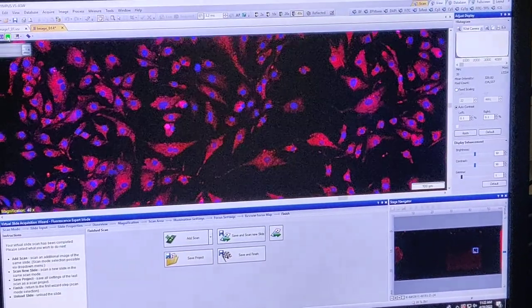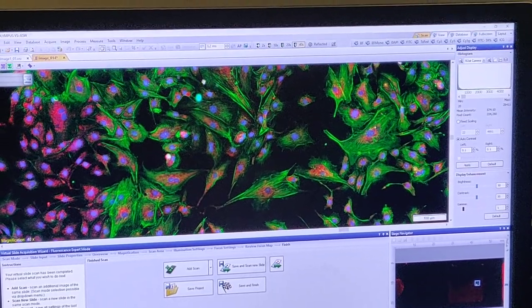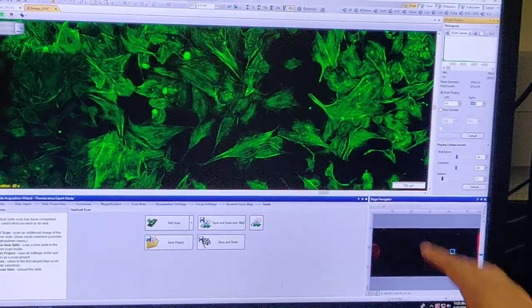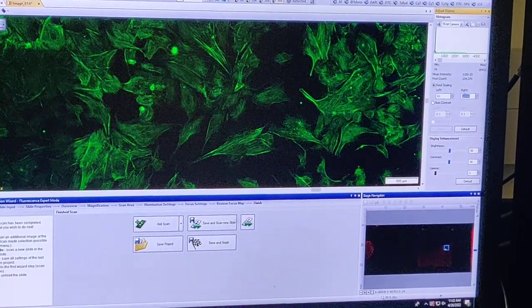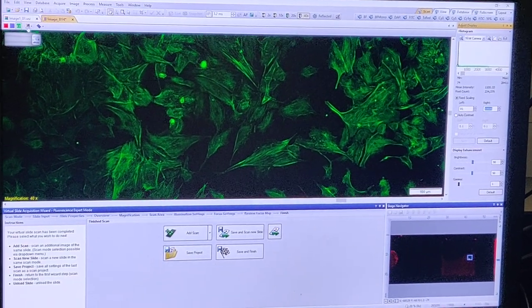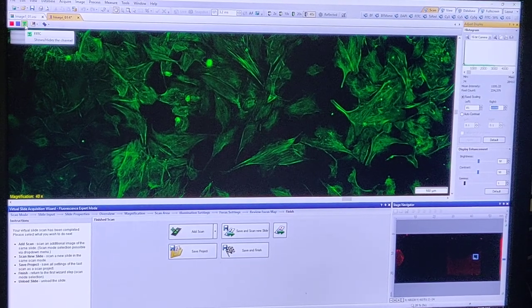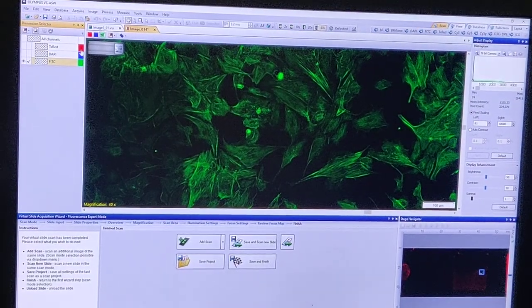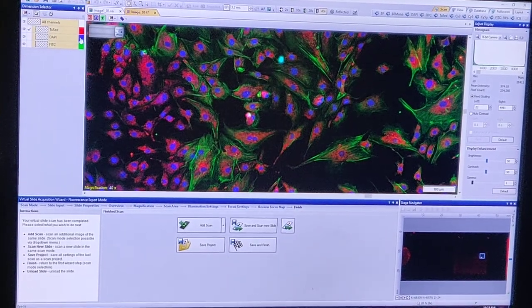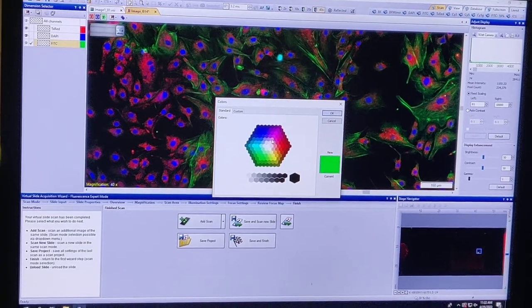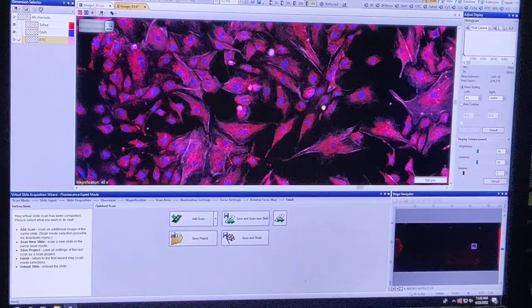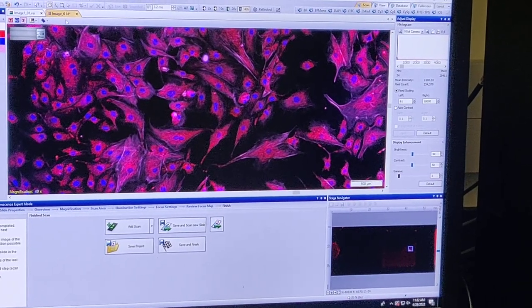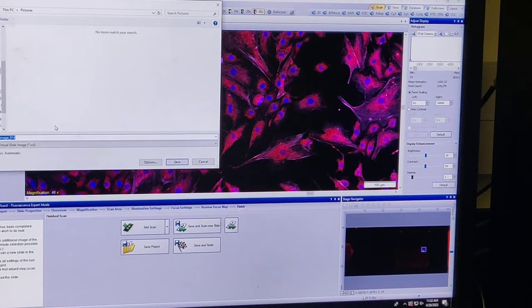You can turn different color channels on and off. If you want to change the intensity of a particular color, close the overlay panels, then adjust in the fixed scale. To make something dimmer, increase the top number — it becomes dimmer. If you don't like the green color and want pink, go to View → Tool Window → Dimension Selector, which lets you choose any color. You can save the image by going to File → Save to whatever location you want.